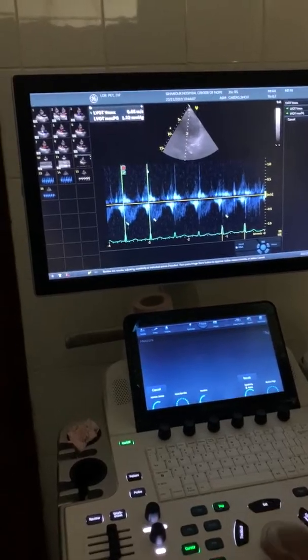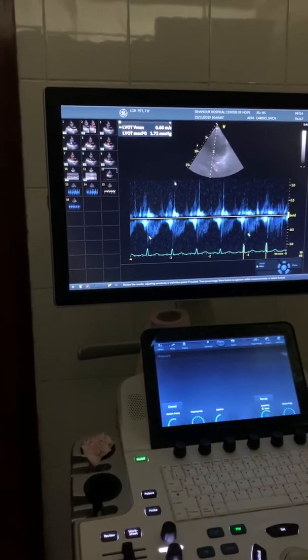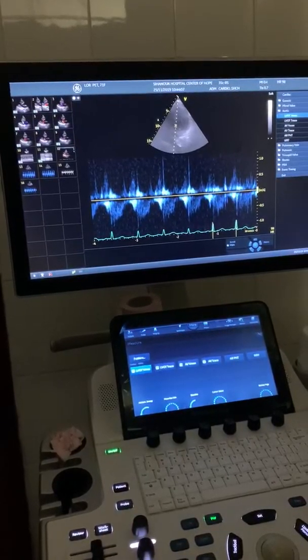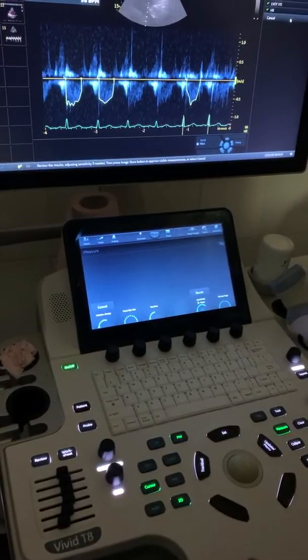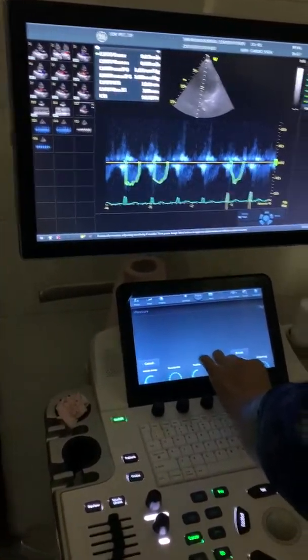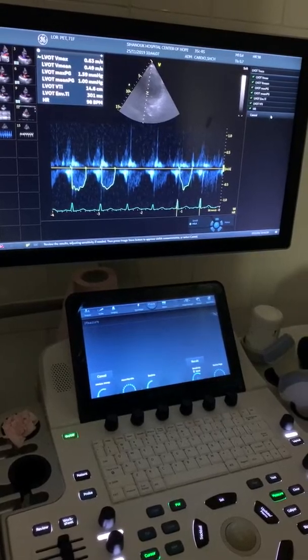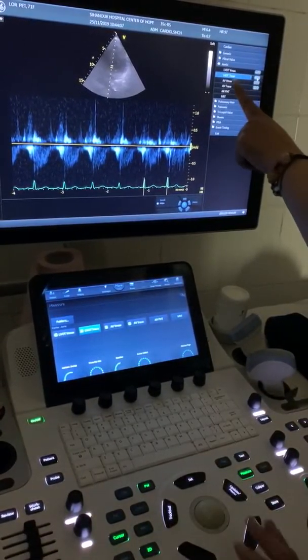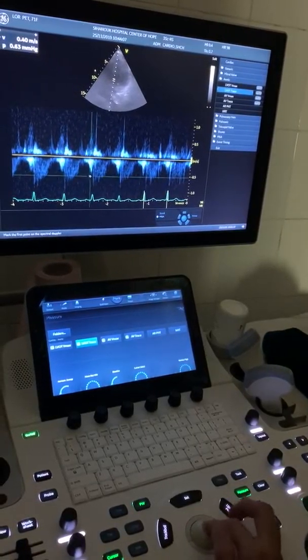If you don't like some measurement, you put a line here - you see there's a line. You say 'I don't like you,' you cross it. I only like this one. Now let's do a good one. Press measure, go auto. Increase the sensitivity because sometimes it's ugly. If you don't want to press auto, you go manual - press, then trace. Usually we put the cursor here.